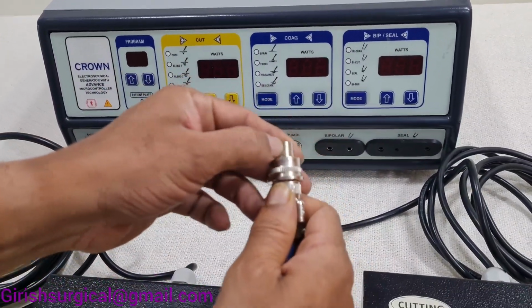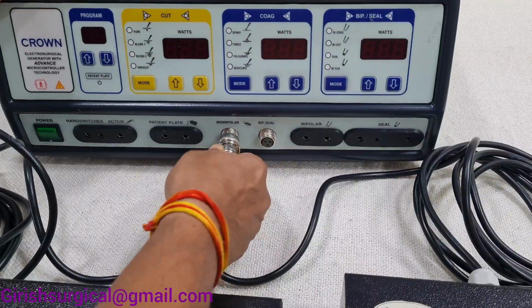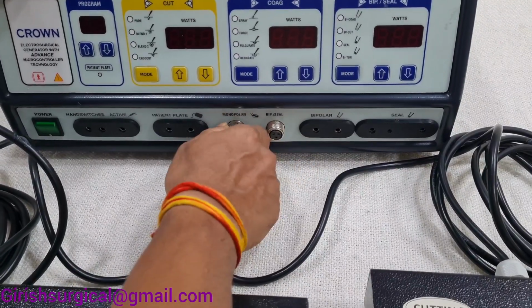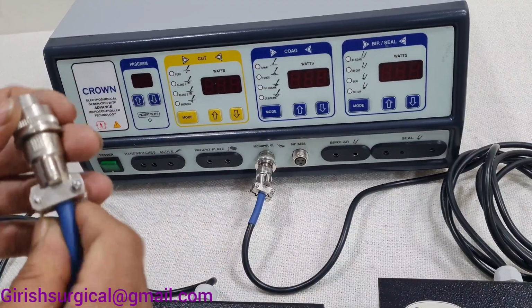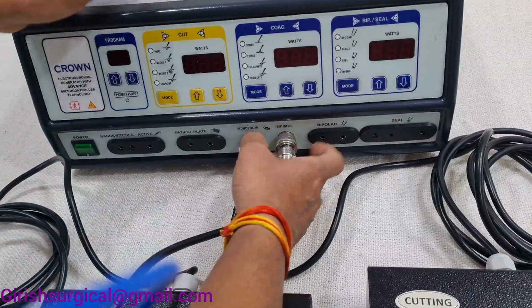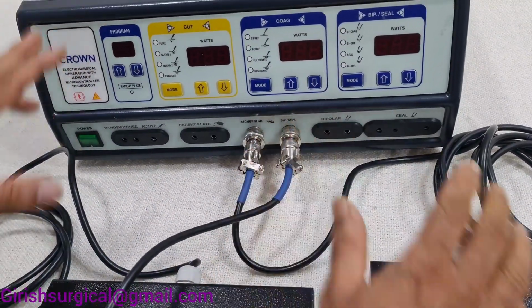Here a slot is there which you have to match to the machine end port, and you have to tighten it properly. Same with the sealer foot switch, the bipolar sealer foot switch. There is a slot, you have to match it, and tighten it.